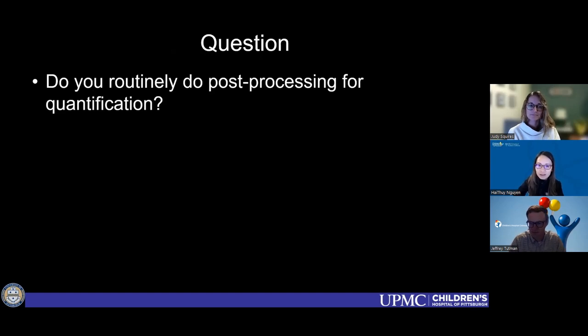Yeah, I do. And there are lots of issues with it, so that's kind of the reason why I propose this question. Even though it's quantification, it's not perfectly accurate, and it varies between different vendors. But when we follow patients over time, it's nice to have just numbers, and who knows if there's anything to glean from it in the future. So I do try to post-process a lot of my exams. But the caveat is we're not that busy as far as volumes. So I would imagine if we had a lot more, like you guys, then we may not have the manpower to do so.